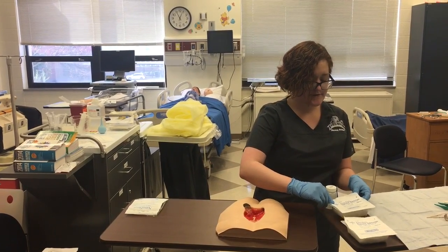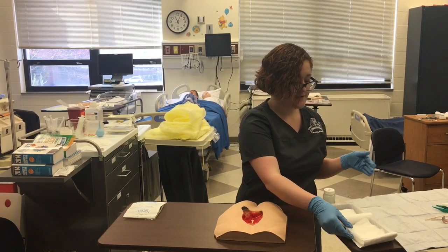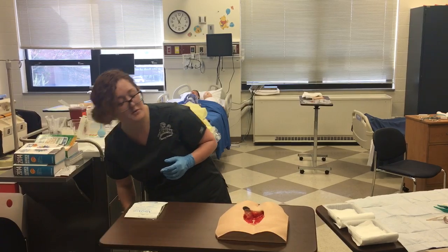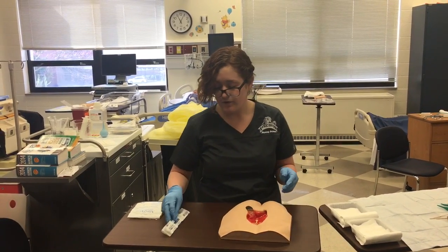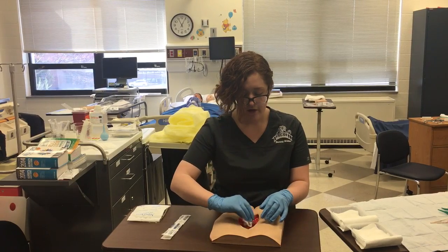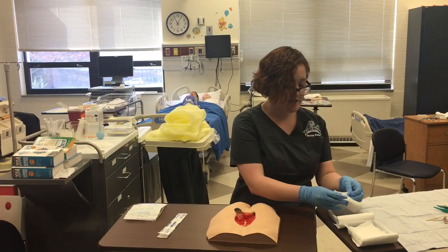I'm going to open my gauze away from me again, because these are sterile. Again, ensuring that I'm not crossing over the sterile field. I am going to pour the sterile solution into both to moisten the gauze, and then I'm going to set this aside so it's no longer in my way. I'm going to bring another pair of cotton tip applicators over so I can check for tunneling of the wound after I clean it. And now I'm going to take one piece of gauze at a time, and I'm going to clean the wound, going from in to out, being very gentle. And I'm going to make sure these are disposed of in a biohazard container.